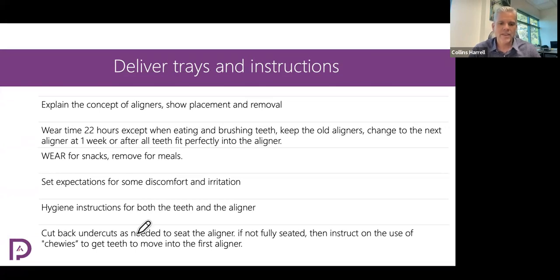Okay, help them understand that they need to brush their teeth and the aligner. I think that's the easiest way to clean the aligner, is just simply when you take it out, brush the inside of the aligner and keep it clean.